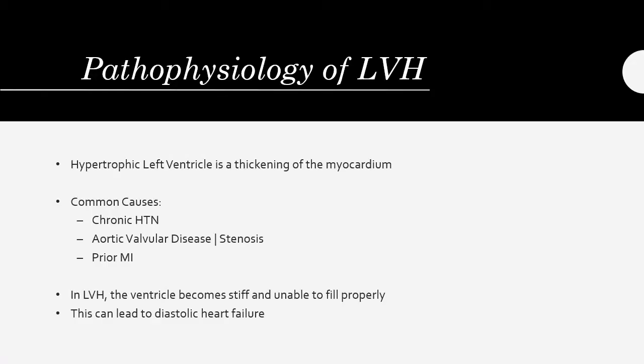Now, identifying LVH on the ECG is important. It's often misdiagnosed as an anteroseptal MI, so we're going to go over how it presents and why, and then that will hopefully shed some light on why it is so misdiagnosed on the ECG.